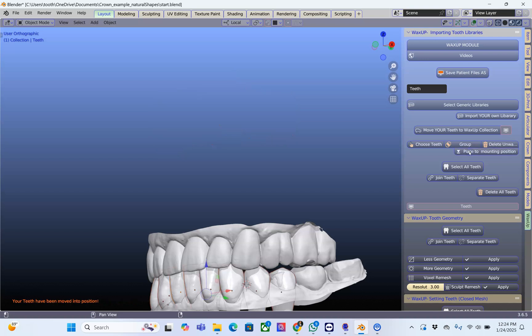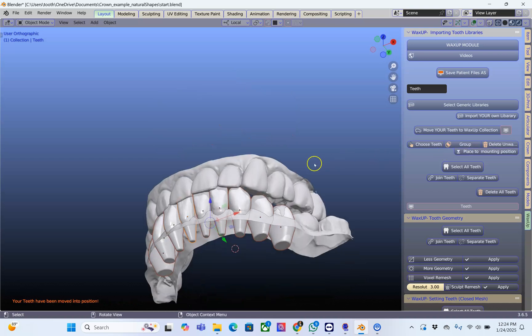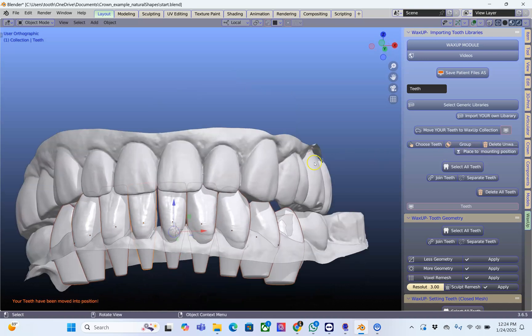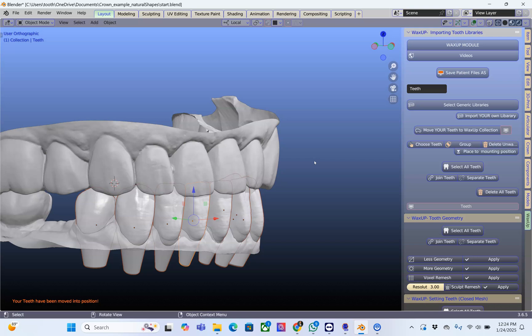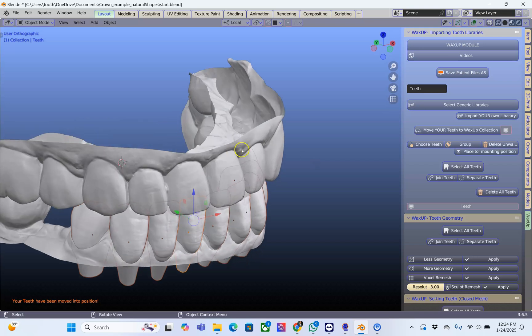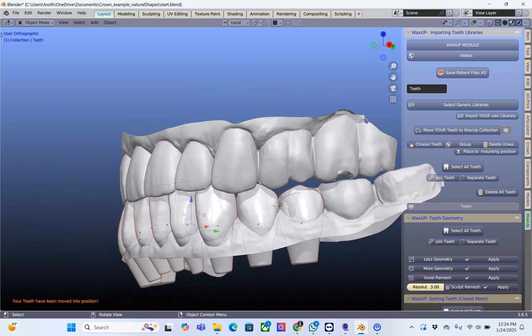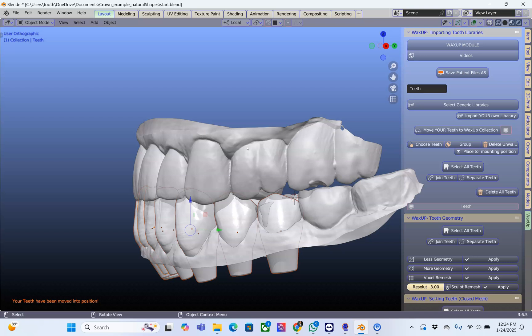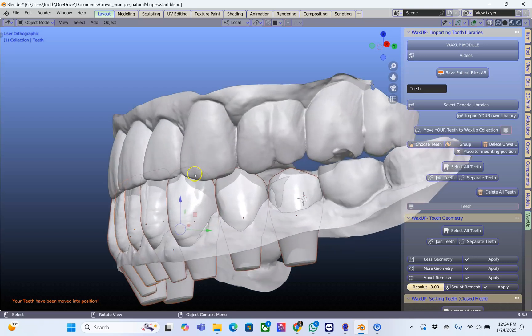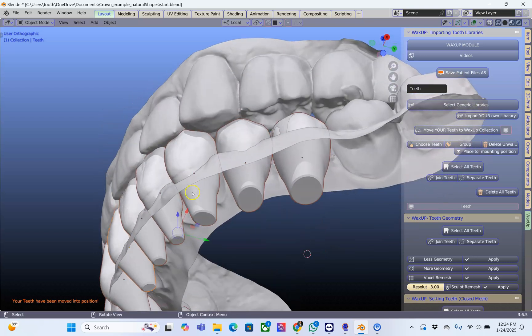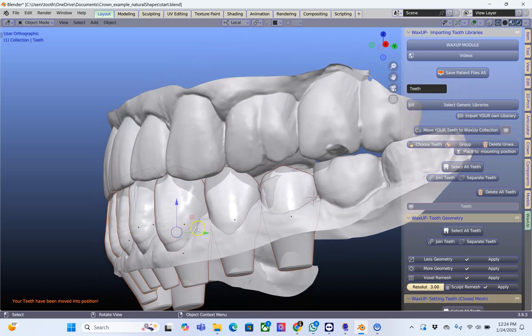Now these teeth may not go exactly where they should be, but if the models are in the correct orientation they should be pretty close, as you see over here. So what I want to do is just make sure I move them into the correct location.